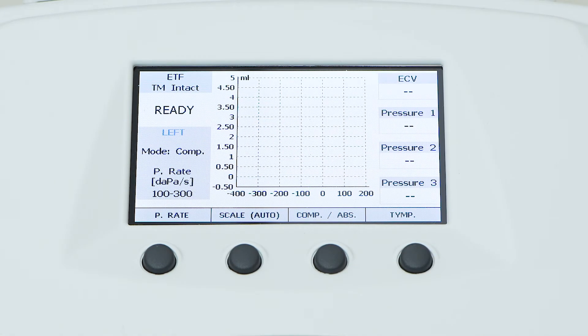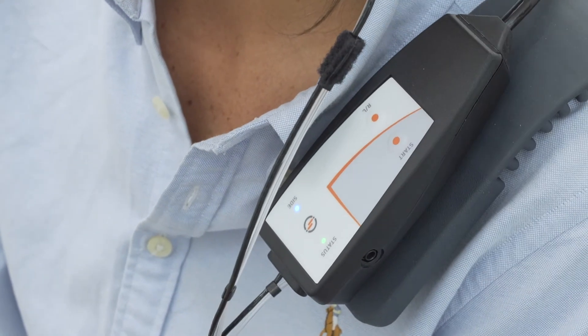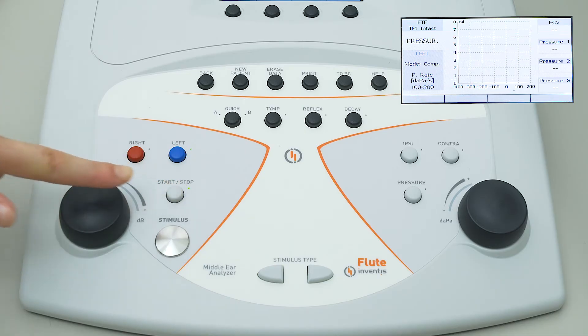This test protocol is based on the automatic acquisition of three tympanograms under different patient conditions. Since the interface is very similar to that of the tympanometry test described in the previous video, we will skip a detailed description. Introduce the probe into the patient's ear canal and start the exam by simply pressing the start button on the keyboard or on the control box.